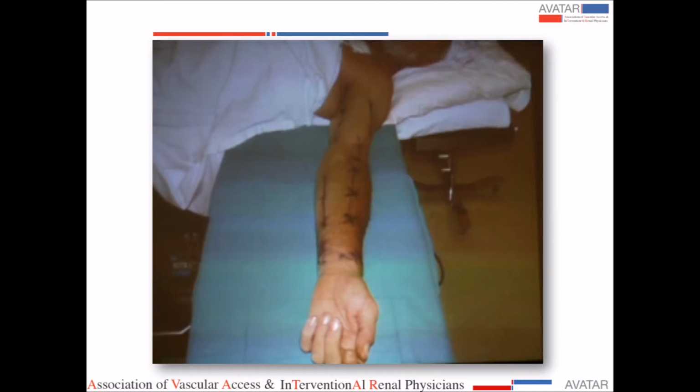And then what I usually start off with is the arterial evaluation. So we'll do the radial, the ulnar, and the brachial, get the intraluminal diameters, make sure there's no calcification, do your Allen's test, and do your differential blood pressures. Then we move on to the veins, and we do multiple measurements along the path of the veins, and then record. The biggest advantage of the ultrasound over angiography is the depth from the skin surface.